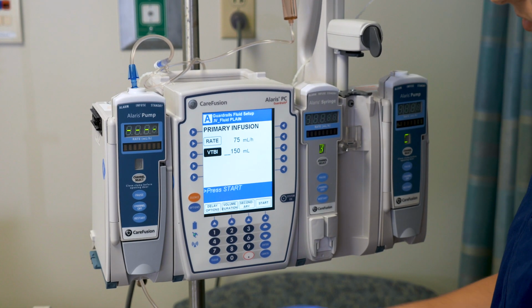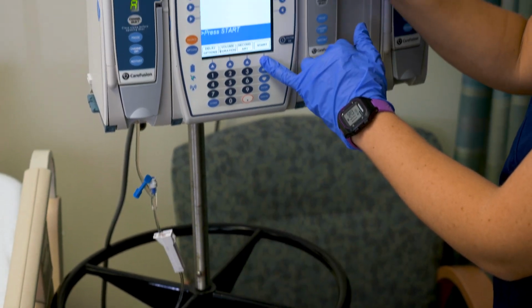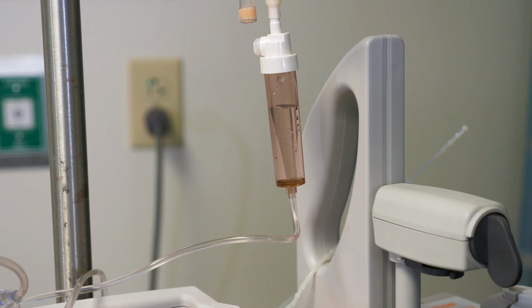We are now going to unclamp our roller clamp and go ahead and hit start. You want to watch the drip chamber to make sure that your fluid is dripping and administering.